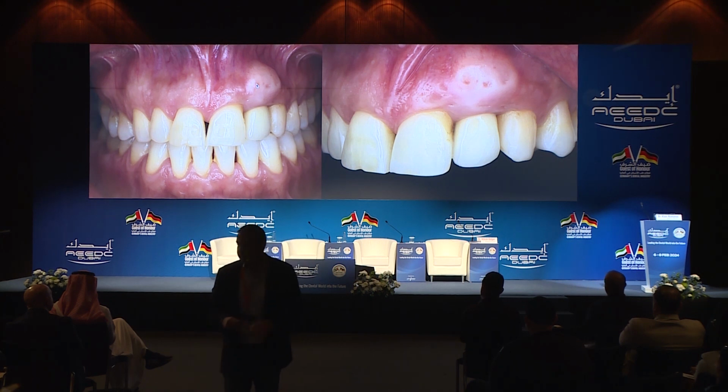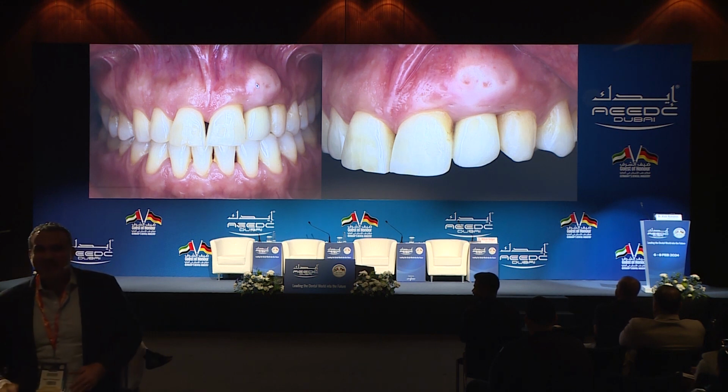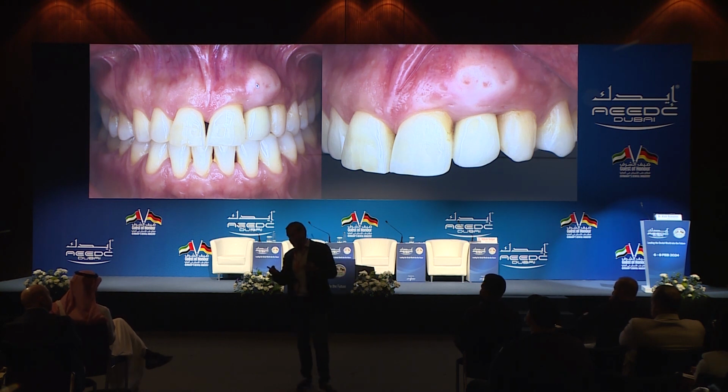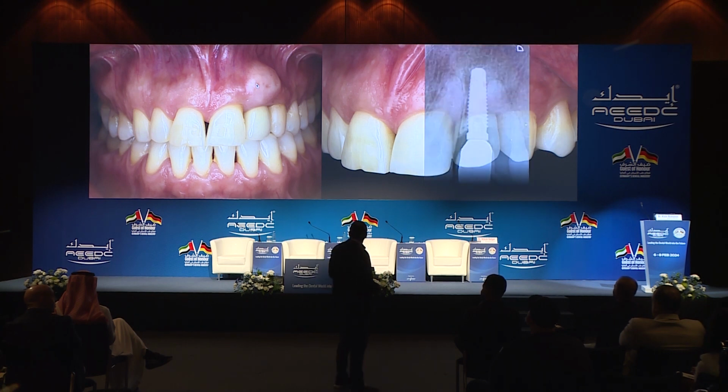Amazing. If you need connective tissue now, you can have a good donor site, okay? So you have an extra donor. This patient has 3 tuberosities. And I learned this from Howie. Howie told me, today, if you have to do it, don't do it with a laser. You just have to flap and take the internal connective tissue graft. You cannot leave it and take it from the outside. And this is after 10 years. This thing keeps on growing. It's crazy. I mean, it kept on growing.